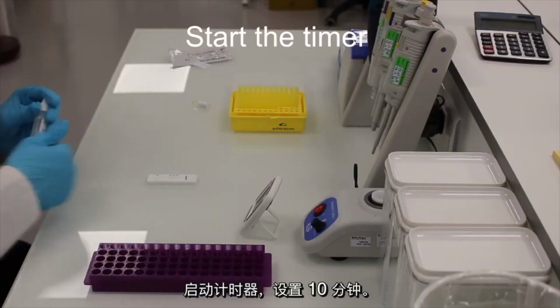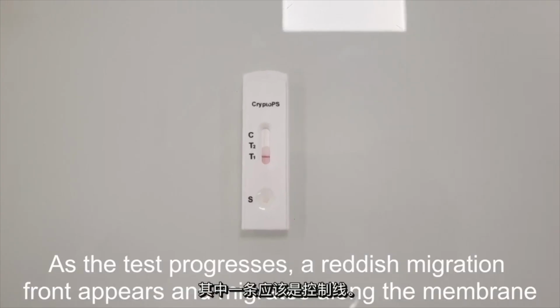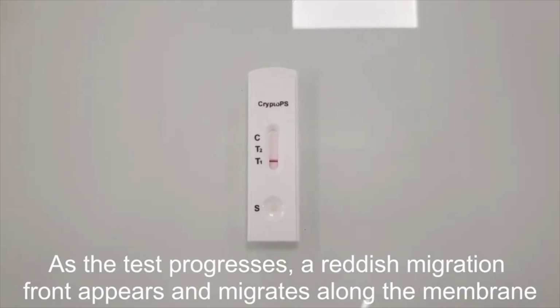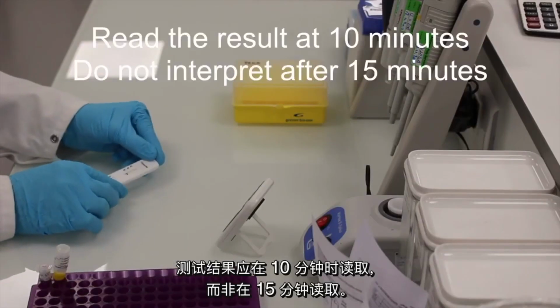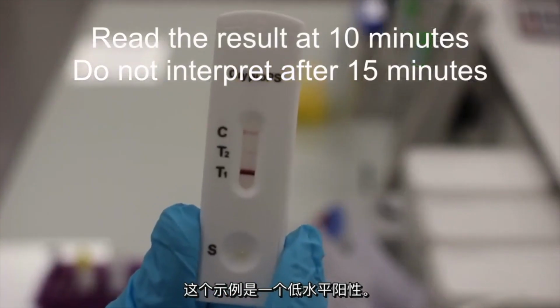You start the timer for 10 minutes and you can see that you could get 3 lines. You should have a control line and you can have a low concentration positive or a high concentration positive. The test should be read at 10 minutes and not at 15 minutes. This example is a low level positive.